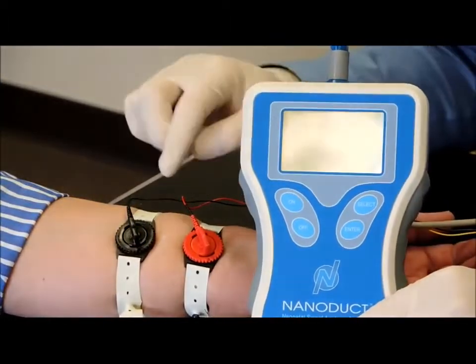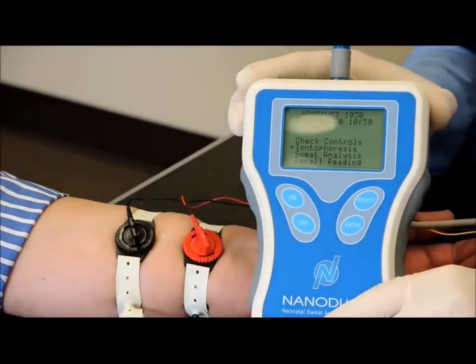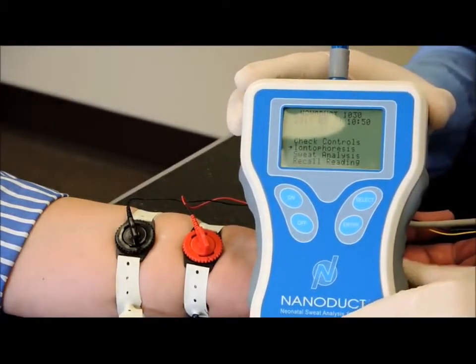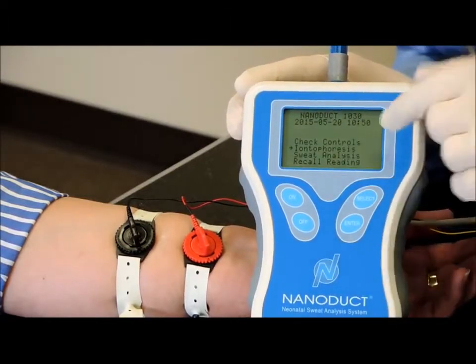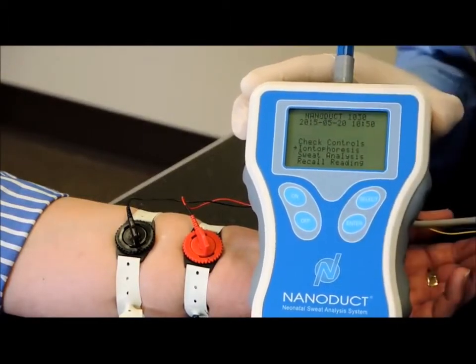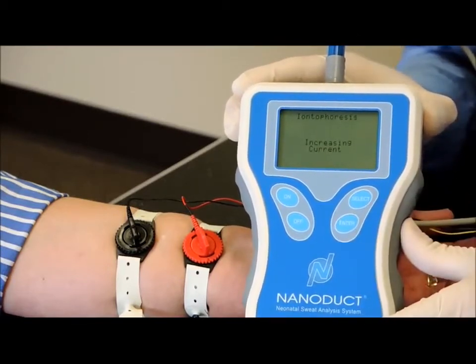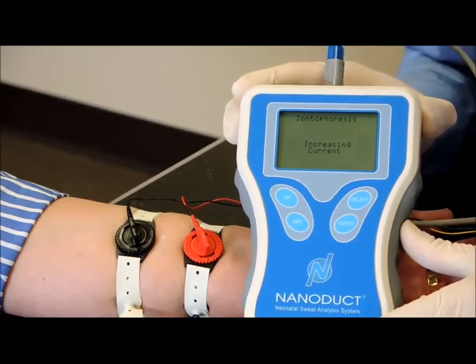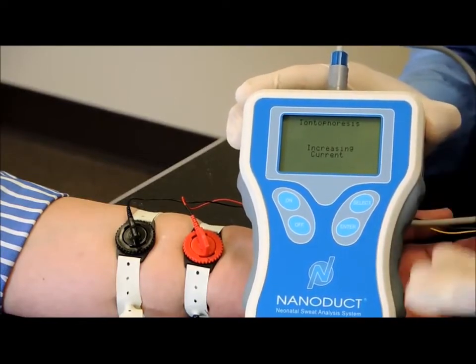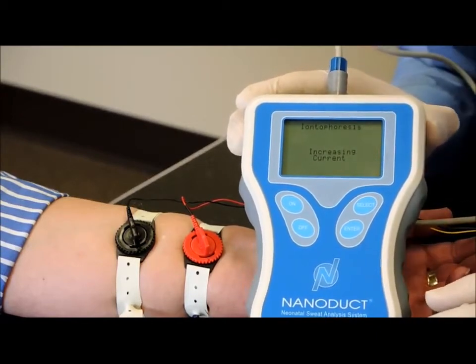Now with the electrodes in the holders and thus making contact with the skin and with the discs in place, always remember to have the discs there. We can now turn on the Nanoduct with the arrow pointed towards iontophoresis. I can press enter, and it will begin the iontophoresis process. This takes 2.5 minutes, and it ramps up the current and then holds the current steady, and then we'll ramp down the current.